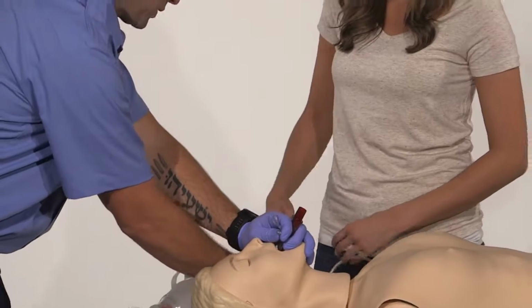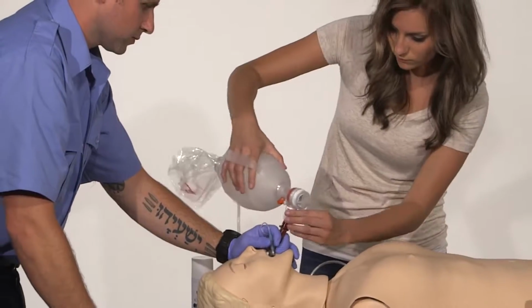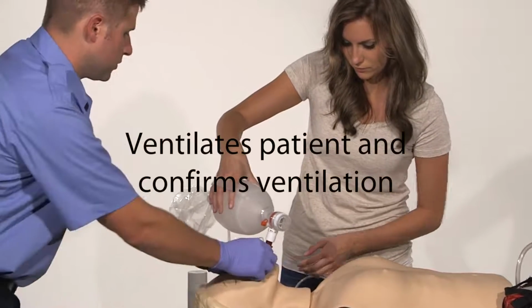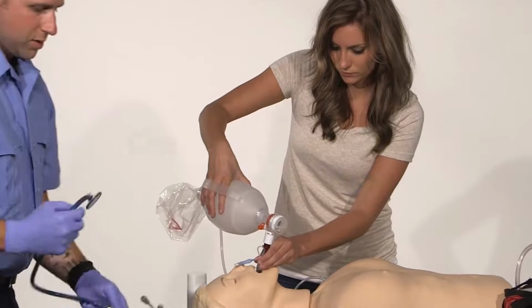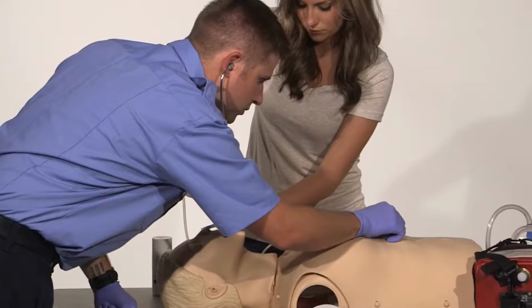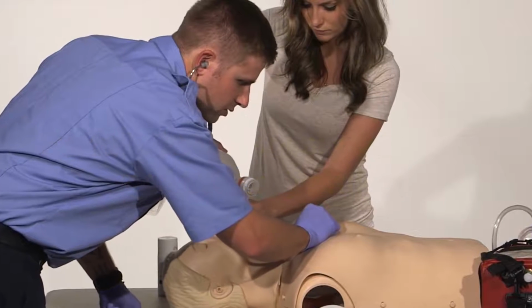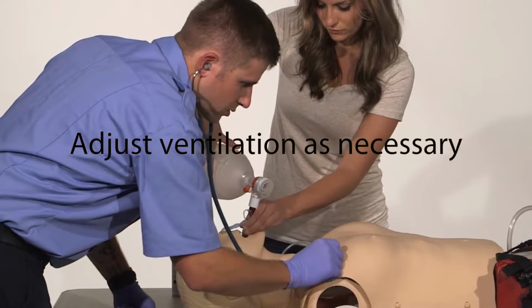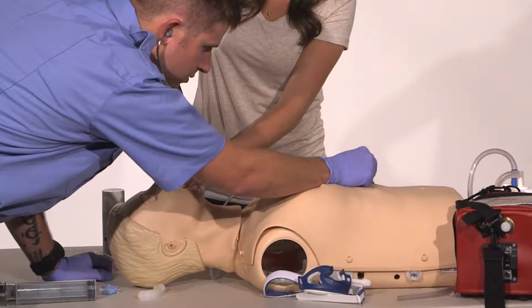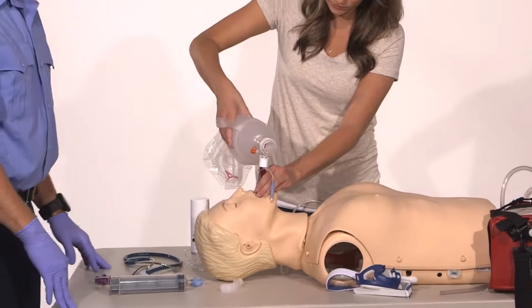Get the bag. Can you connect the bag onto the... Alright, can you secure that? Alright, I'm going to use my stethoscope. Check for sounds over the epigastrium. And check for breath sounds in all 4 quadrants. Okay. I don't hear any sounds over the epigastrium. I hear breath sounds in all 4 quadrants.